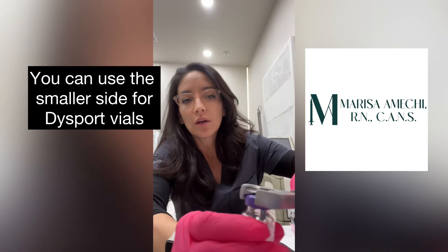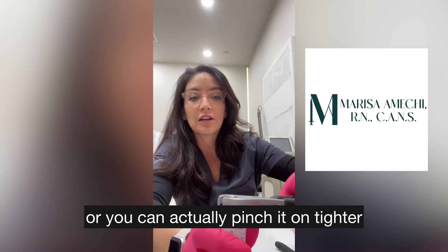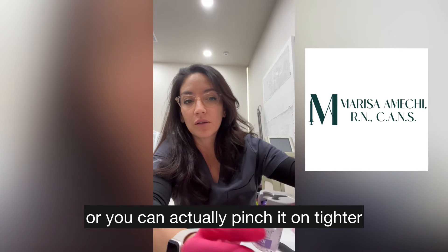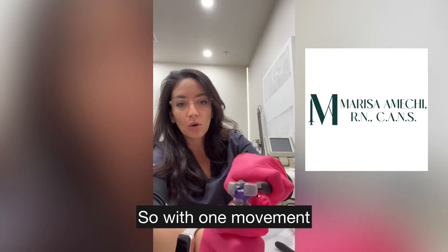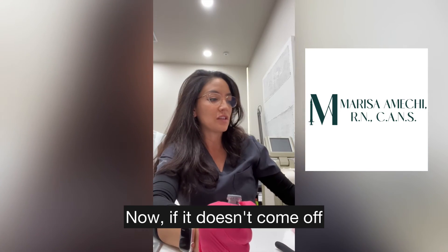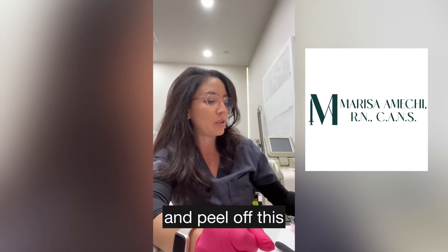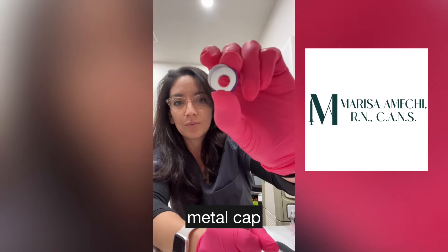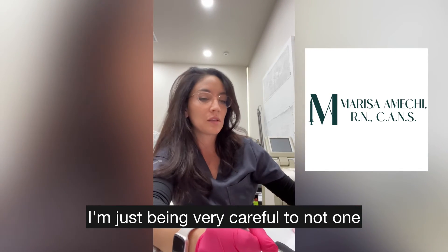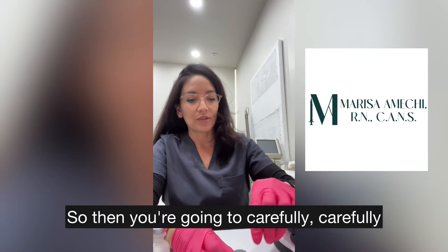Then you take your bottle decapper — I'm using the 20-millimeter side — and pinch the cap with the decapper, being very careful not to apply too much pressure, because you can pinch it on tighter or break the glass. With one movement, twist your wrist and it should come right off. If it doesn't come off, you can use the sides of the decapper to peel off the foil and the metal cap, being careful not to cut your fingers and not to break the glass.